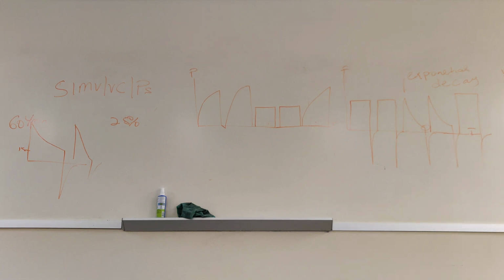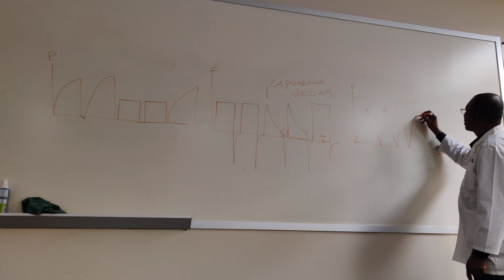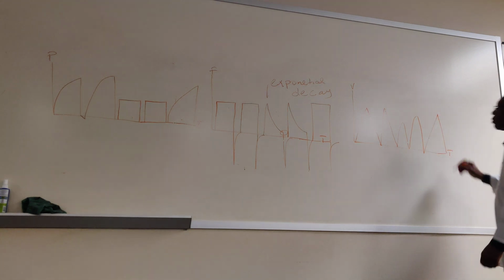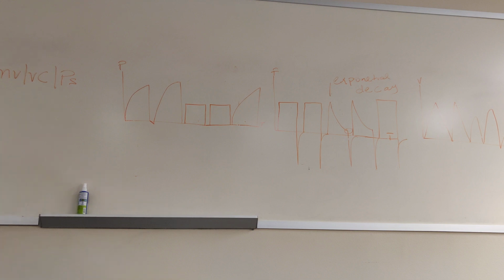Okay? On pressure support, the tidal volume varies. The exhale tidal volume varies. So on the next breath, you may see something like that. When they get huge tidal volume, like that. Or maybe smaller than that when they don't take enough I time to breathe in. Okay, so the tidal volume is everywhere on pressure support. And then you have another machine breath. So that's the way SIMV VC with pressure support is going to look. Now let's do pressure control.